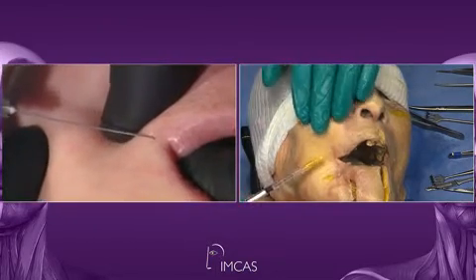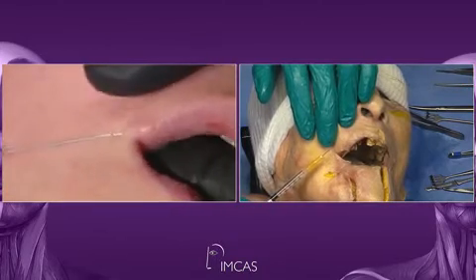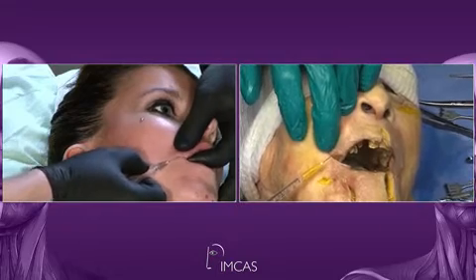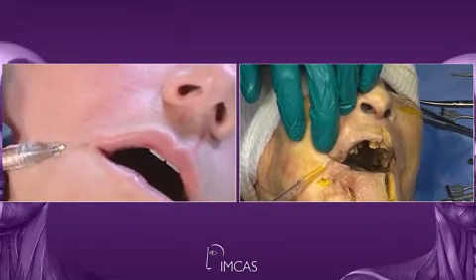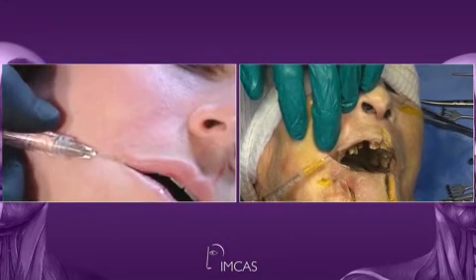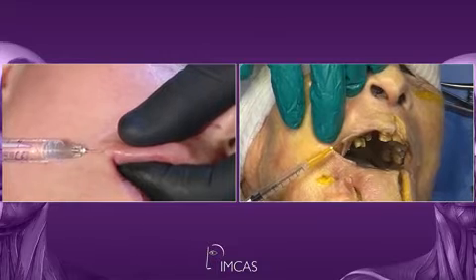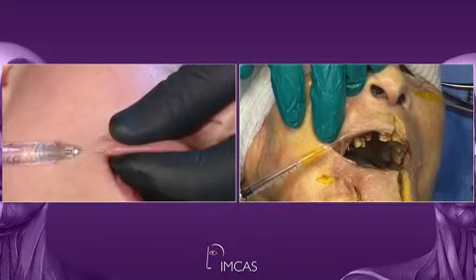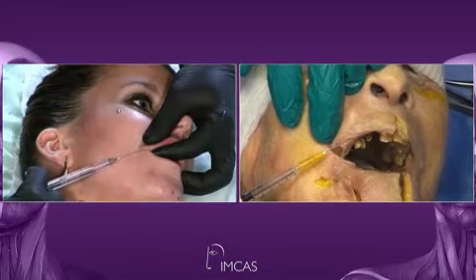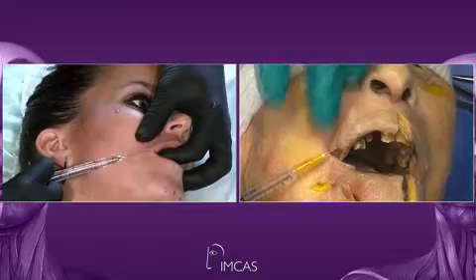So let's see. First of all, since she has no numbness, I just enter very gently that plane on top of the orbicularis oris muscle. And I'm actually right now basically in the transition between the wet and the dry mucosa. A small injection here will just numb the lip. So the target is to volumize the upper lip. It's not the shape, it's the volumization, right? We're going to try to change the shape with volume as well.